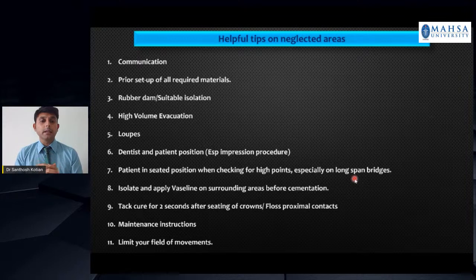Isolate and apply Vaseline around surrounding areas before cementation. I already discussed this point. Very, very important for a proper cleanup after the cementation procedure, whether it is temporary or permanent cementation. Tack curing, again, very important, makes it easier for you to remove the excess permanent cement, and floss the proximal contacts for any excess cement. Otherwise, your patient will come back with gingival inflammation.